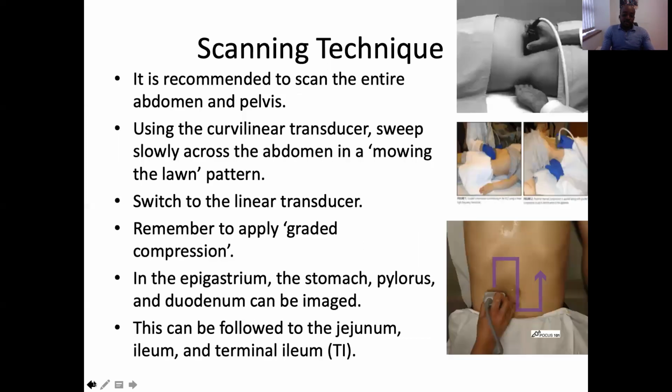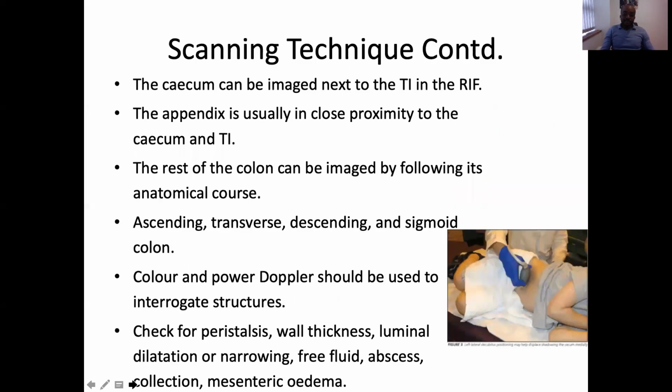And that's partly because you're sitting on the right side of the patient here. So you want to get the distal-most part, the part that is away from you, first, and then you can follow that course slowly until it comes closer to you. That way you're working your shoulder less, and you don't lose muscle tone when you get to the other end. Instead, it's coming closer to you, so it's easier and you're able to focus more on the scanning.